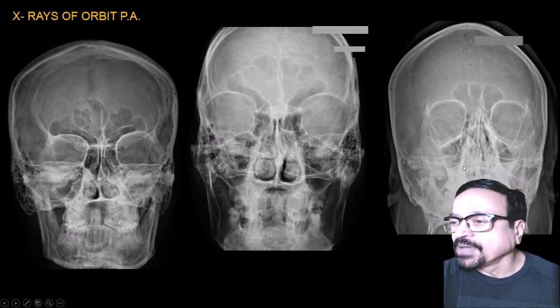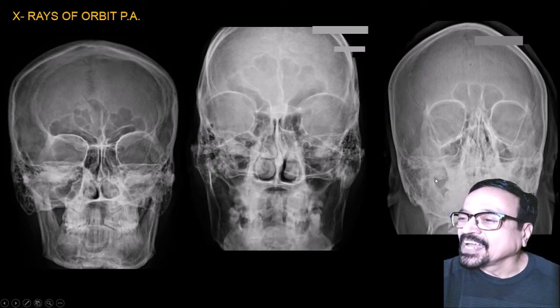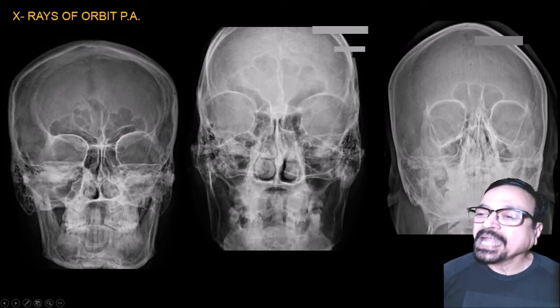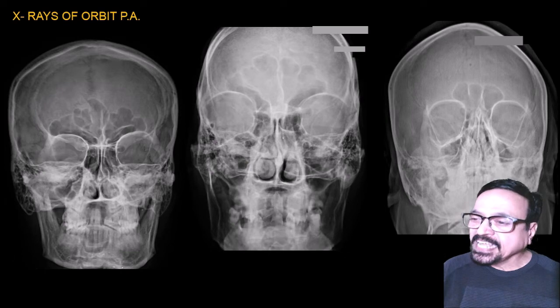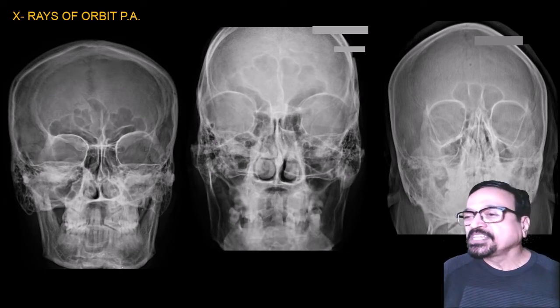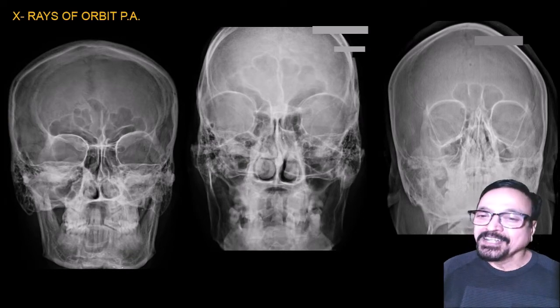Now this is the third one. In this, what has happened is the petrous has gone beyond the maxilla. That means it is practically approaching a Waters view. So in other words, orbit is seen but it is more likely to be distorted. So that's how we know whether the orbit is distorted, whether the orbit is taken properly or there is going to be any correction. Who guides us is the petrous. The position of petrous should be a little beyond the inferior wall of orbit.